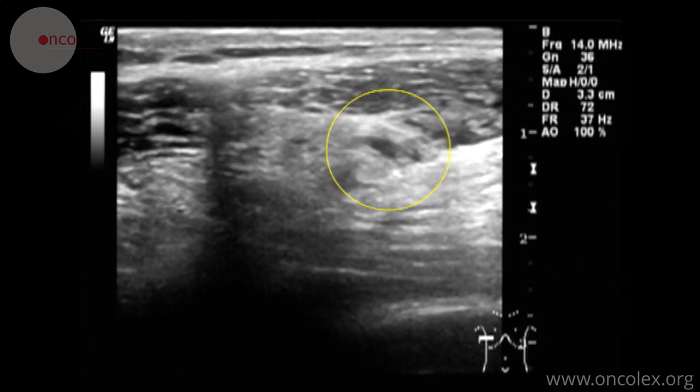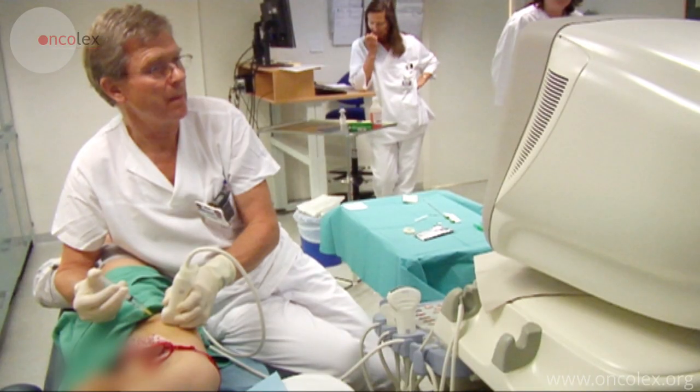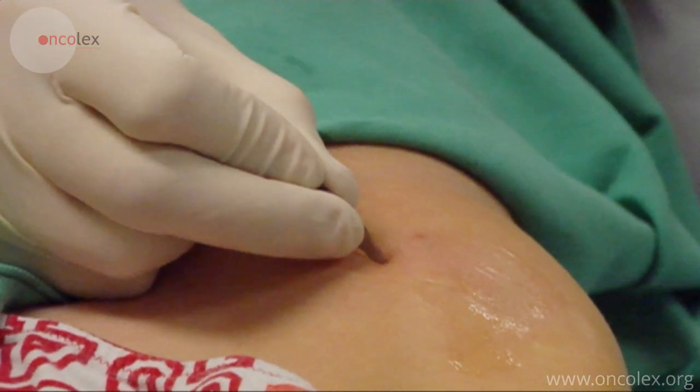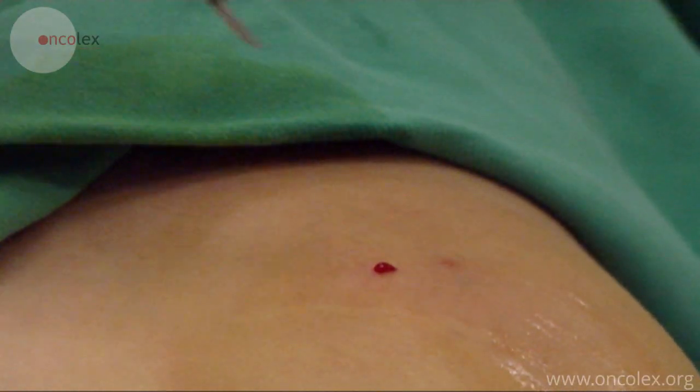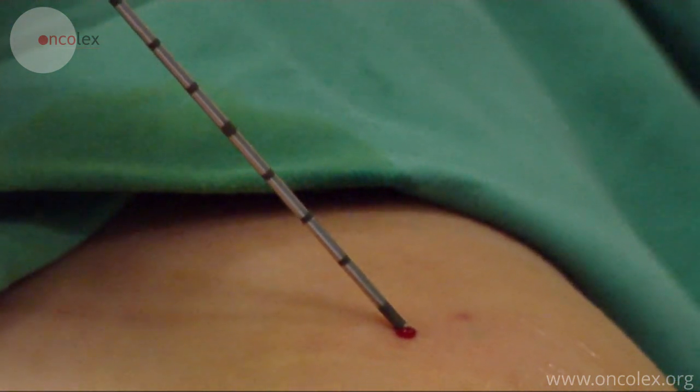Here we see the needle in the lesion. To avoid unnecessary trauma to the skin, a small incision is made in the skin with a scalpel blade. The biopsy needle is inserted into the lesion.